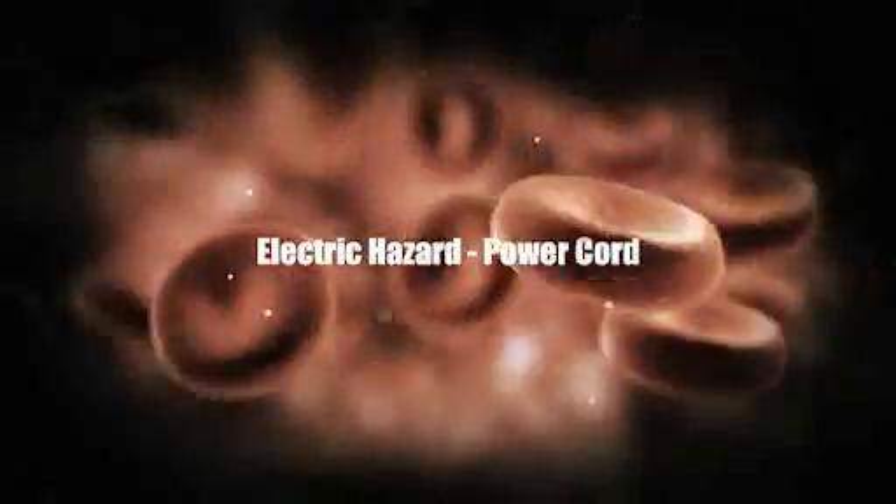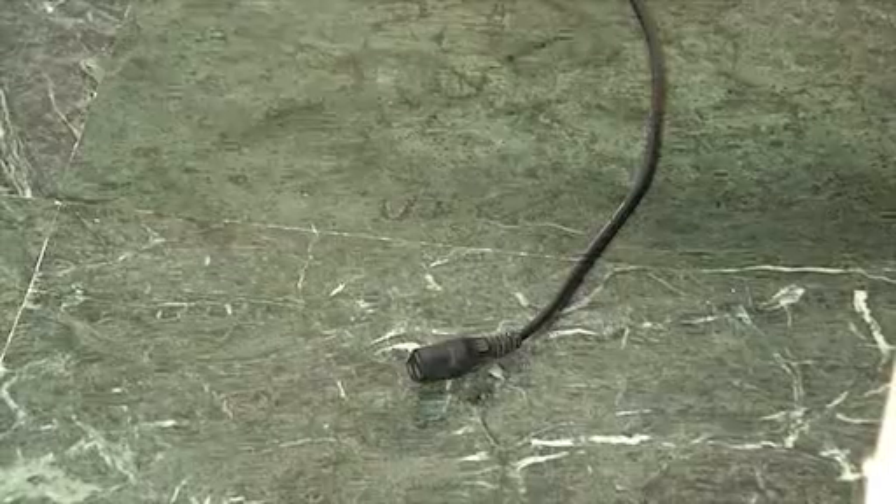Electric hazard — Power cord care. Do not unplug and leave the power cord on the floor. It may get wet and conduct electricity, creating an electric shock then or later. It should be kept off the floor and away from any liquid.